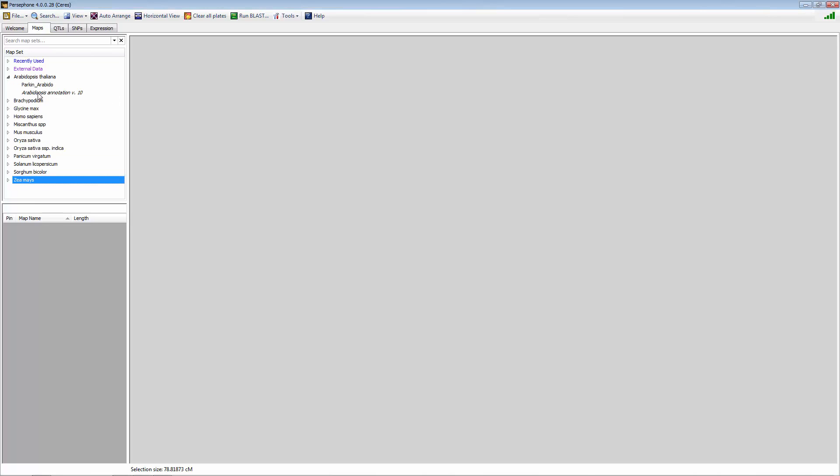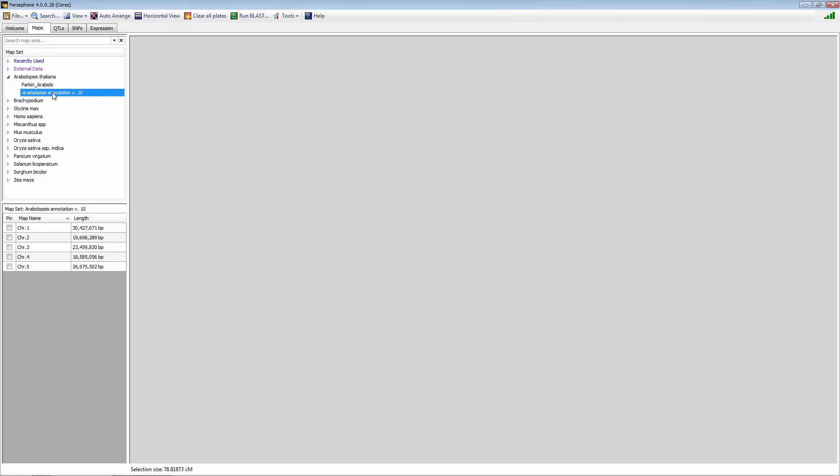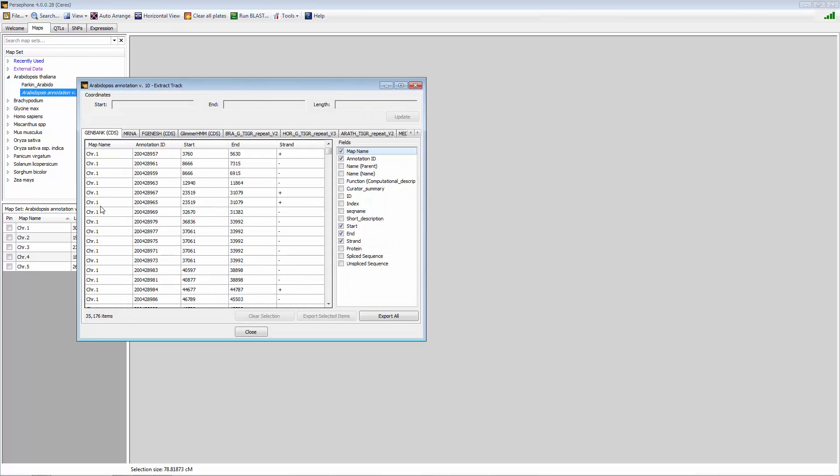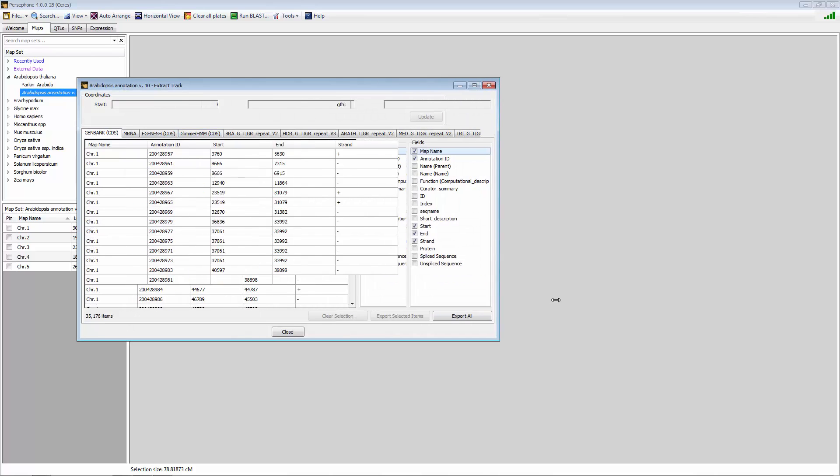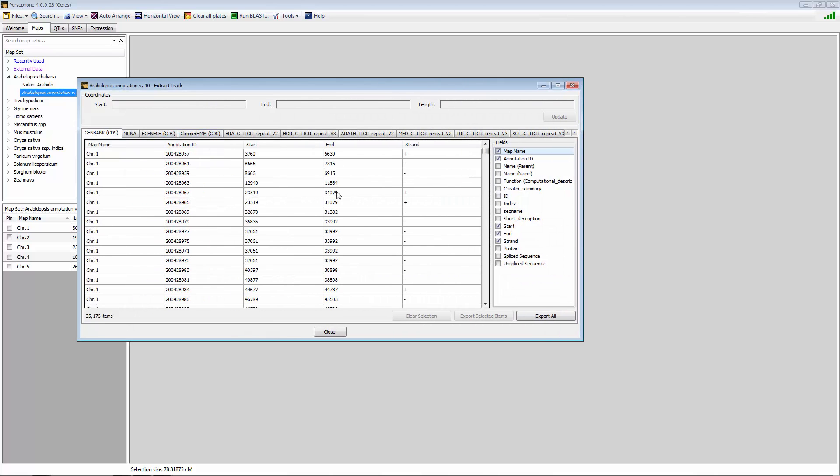If you select an entire map set, which would be an entire genome in this example for Arabidopsis, if you right click on that map set name, you can go to the export tab. And this will then bring up another interface that allows you to configure the data to how you want to export.